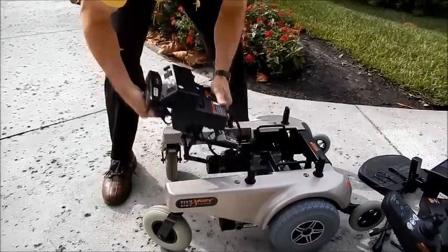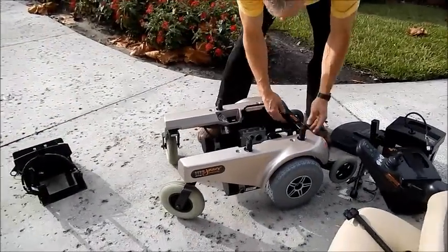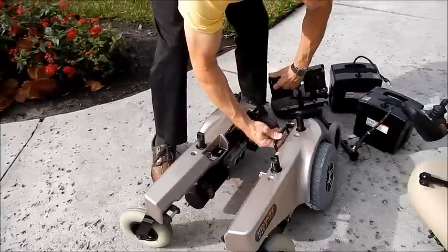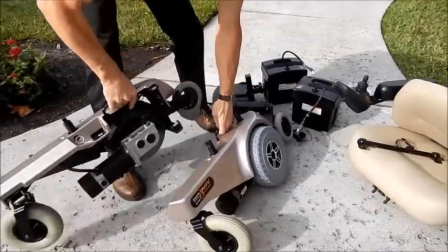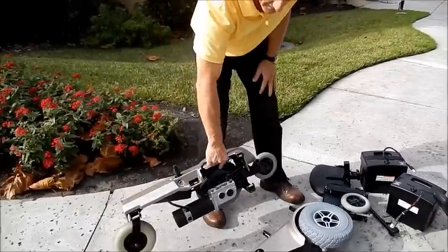Take the rear off. And you can take the front off. And now you have the heaviest piece in my hand.